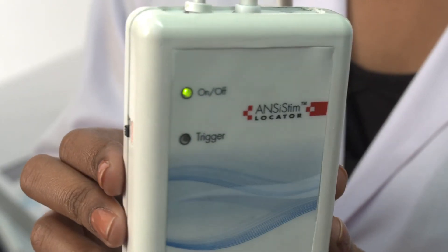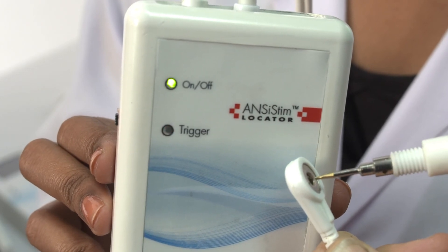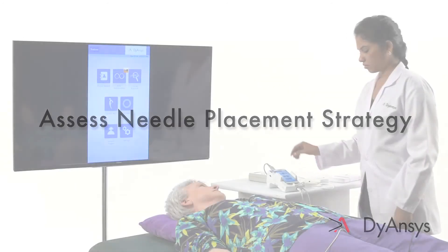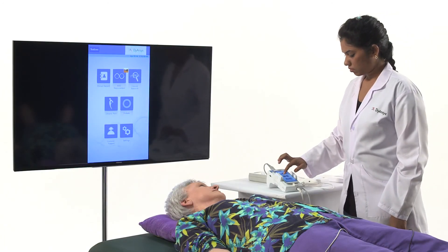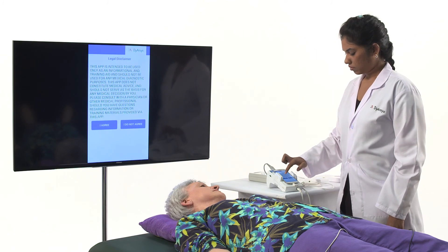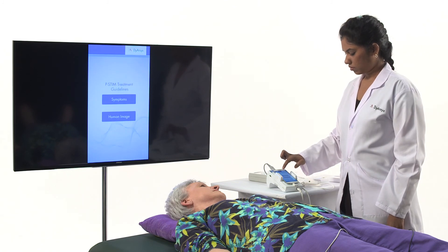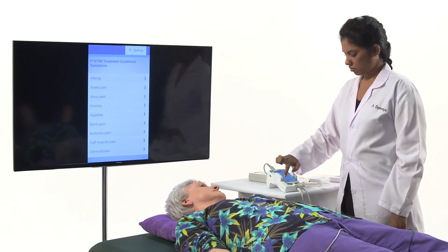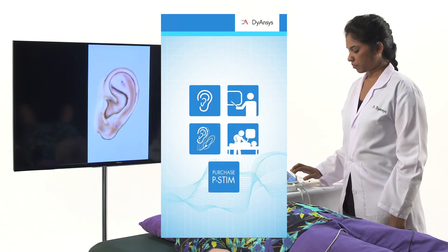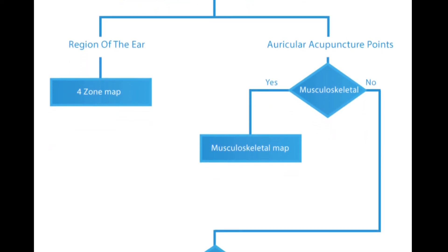Prepare the ANSiStim needle locator. Switch on the device. Press the probe tip to the grounding strap to assure the locator is properly functioning. Assess needle placement strategy. Select the Chronic Pain icon and then the Learning Training icon. Locate the points on the ear using the P-STIM Treatment Guidelines icon. Select either the Symptoms icon or the Human Image icon.